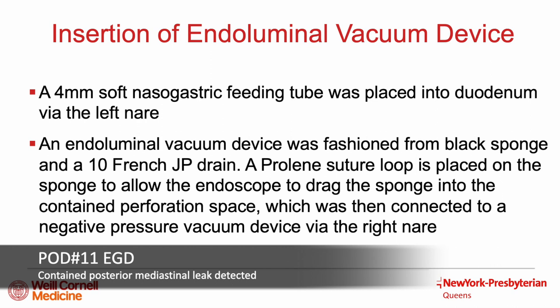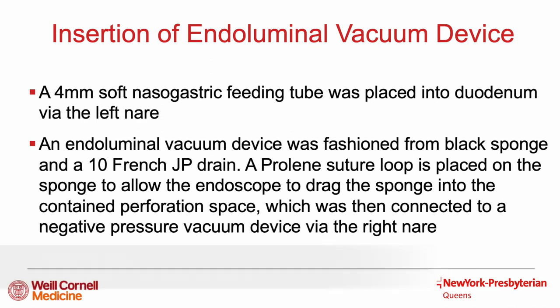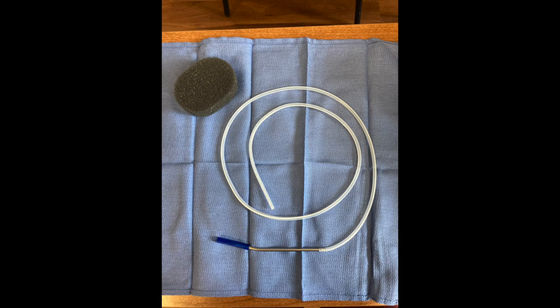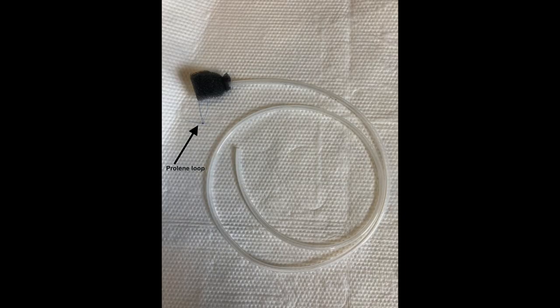Due to the patient's hemodynamic stability and contained mediastinal anastomotic leak, the decision was made to manage the patient conservatively with endoluminal vacuum therapy and nasal postpyloric feeding. A 4mm soft nasogastric feeding tube was placed endoscopically into the duodenum. While there are prefabricated commercial endoluminal vacuum devices available, these devices are also easily constructed from materials already found on hand in most operating rooms. We constructed our device from a black sponge and a 10 French round JP drain. A proline suture loop is placed on the end of the sponge to allow it to be directed via the endoscope into the leak cavity. This device was brought out through the right nare and connected to a negative pressure vacuum device.